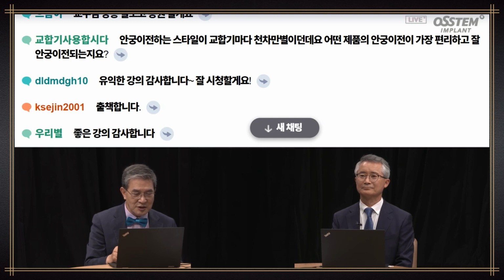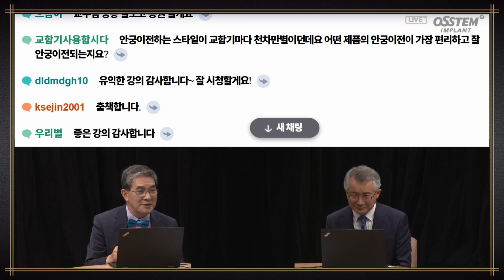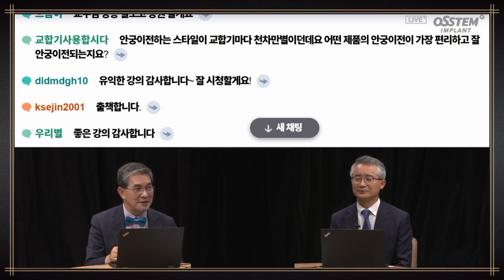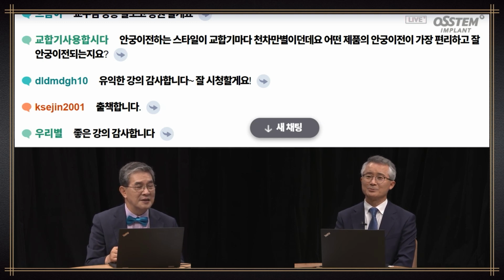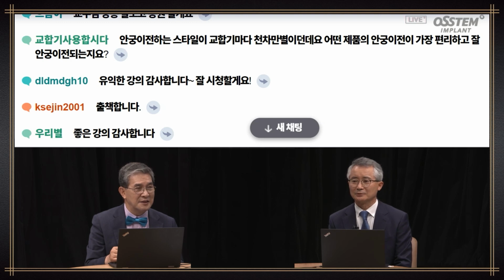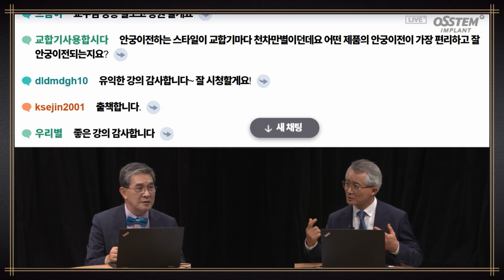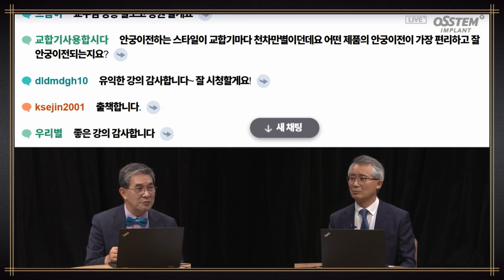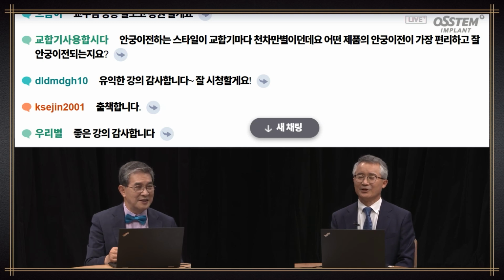Let's use an articulator. The facebow transfer style varies significantly depending on the articulator. Which product provides the most convenient and accurate facebow transfer? Which product do you recommend? I've mentioned this earlier. We used to use Kavo a lot. The Kavo facebow earpiece is very significant. I don't understand why it is so big. I think a Westerner has bigger ears than us.